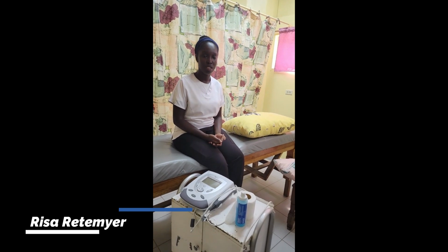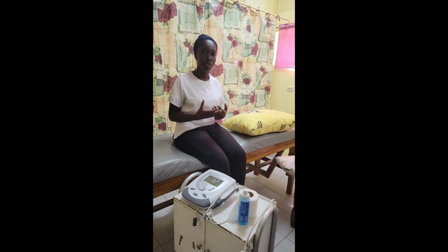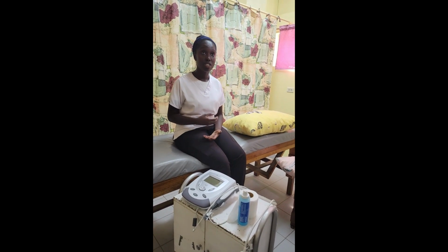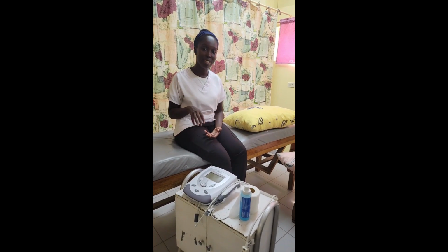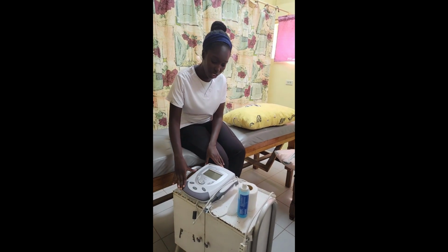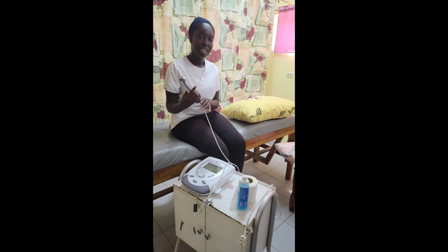We also have a case where the patient had a spine injury. However, for this patient, because of the severe levels of pain that she was experiencing, she is currently on ultrasound guided therapy. That was very interesting. So this machine is the ultrasound machine. What it does is emit rays to the soft tissue.